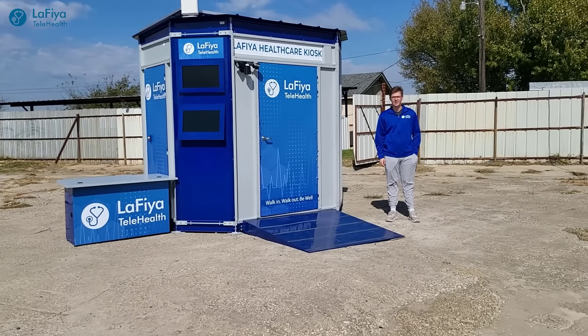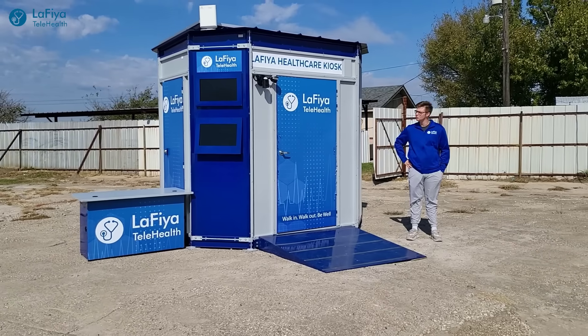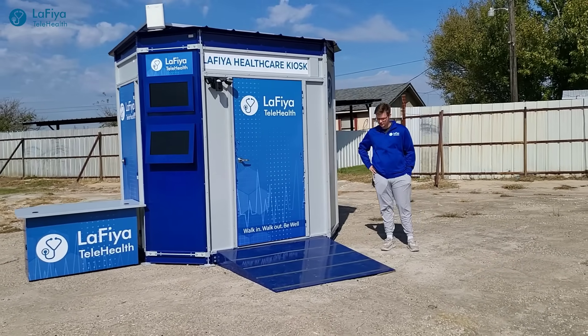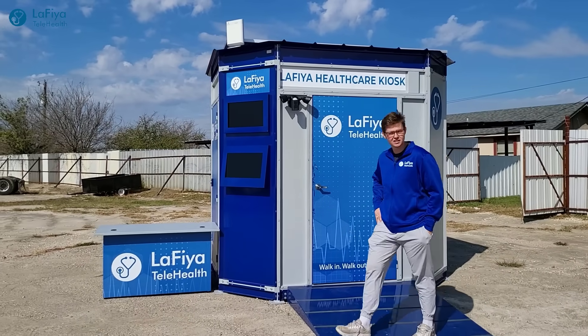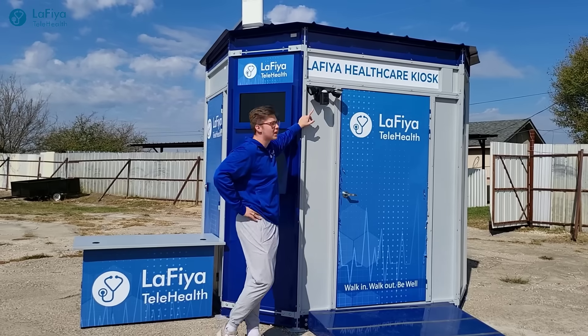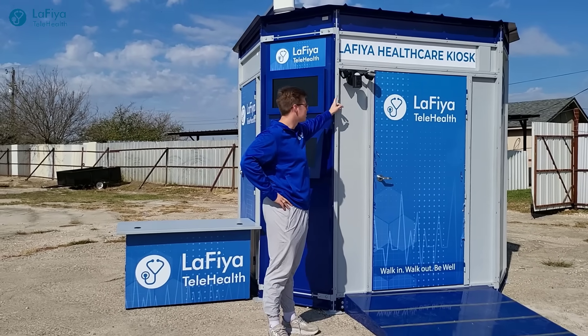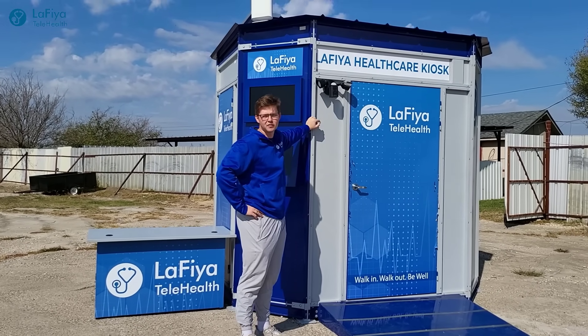Hello, my name is Jackson Samari and I'm with LaFiya TeleHealth. We are outside the new medical outdoor kiosk, and today I'm going to give you an inside and outside look at what this can do. First, this kiosk is monitored by a Ring doorbell and camera, so it's going to monitor everything going on outside this kiosk 24/7.